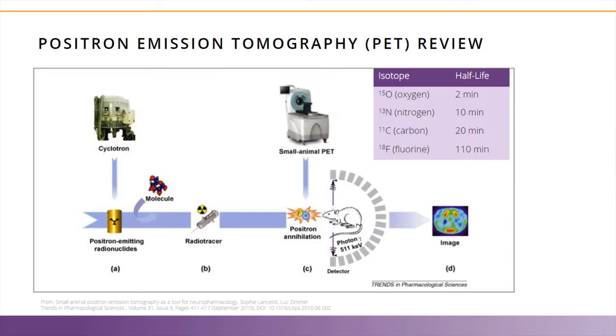In this case, the animal is placed into the PET scanner and an image acquired. A PET image alone will only show where the signal is present, and it will be located within three-dimensional space. However, without an anatomical reference, there is no way to know where the PET signal originates from.